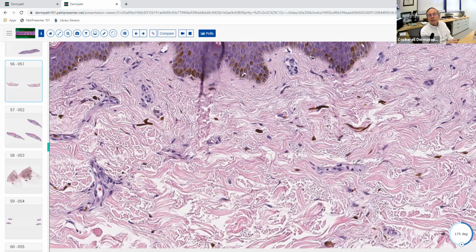So basically, you can't do that anymore. But melanin is usually homogeneous. It's fine granules. You don't see these large crystalline-like granules. So this is not any kind of drug or any kind of iron-containing product. So this is nevus of Ito. The question there is asking you to recognize it's a variant of blue nevus, and then know the anatomic location of that entity.